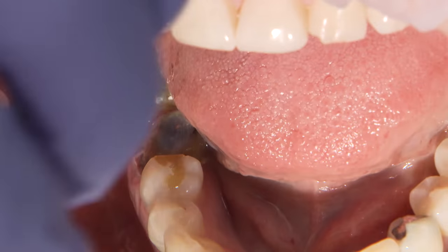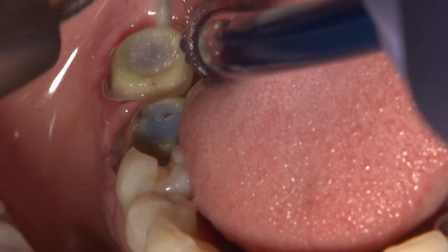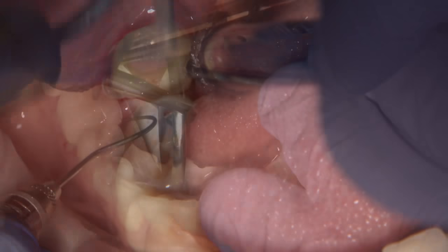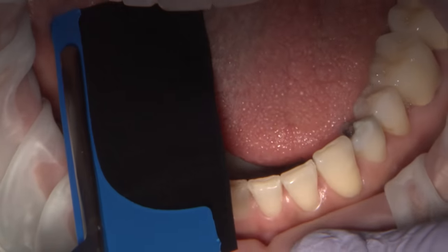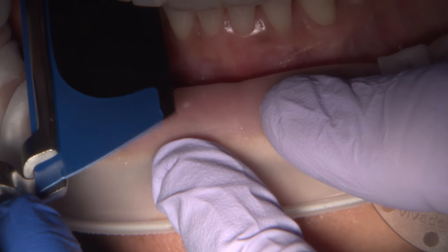Here is the final delivery appointment. Biotemps were removed, and note the ease with which the inlay is removed. Preps were cleaned from the excess cement using the Cavitron. Here is inserting the final restoration and inspecting contacts and margins for proper fitting. Also, occlusion was checked for any interferences to confirm a stable bite.